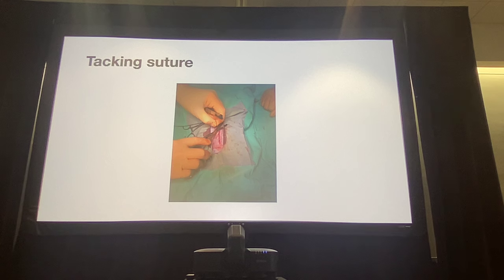For an enteroplication, I'll do it. So again, it all depends on what you want to do. Let's say I do an intestinal resection and anastomosis. I take one or two segments of the intestine, move it around, and I just tack it out to my incision. You can just draw it and that kind of thing.